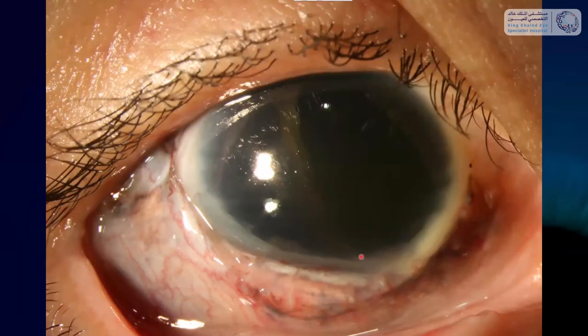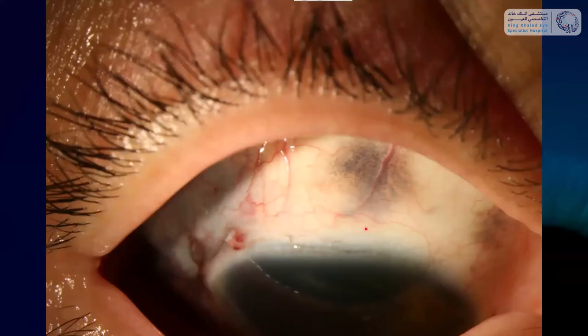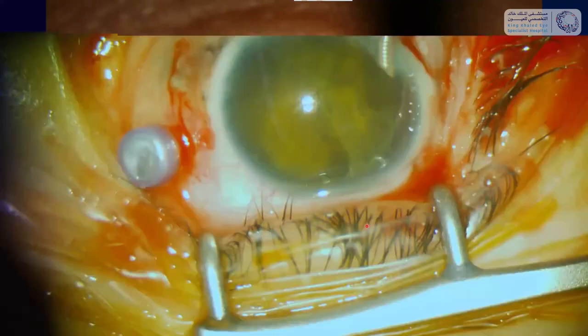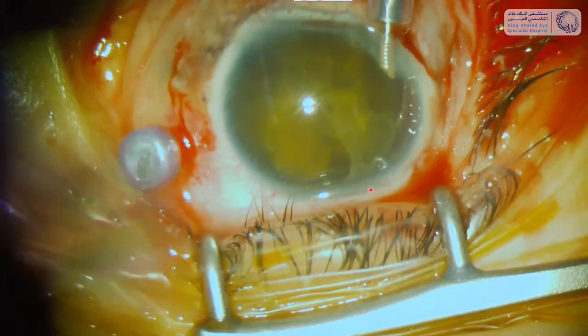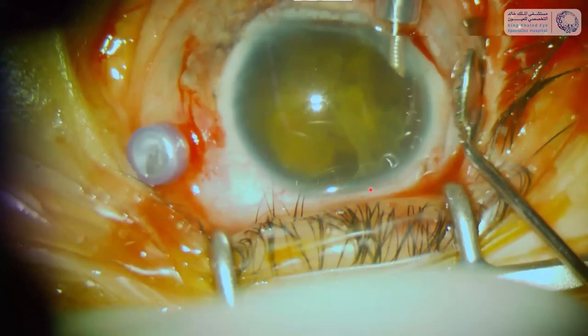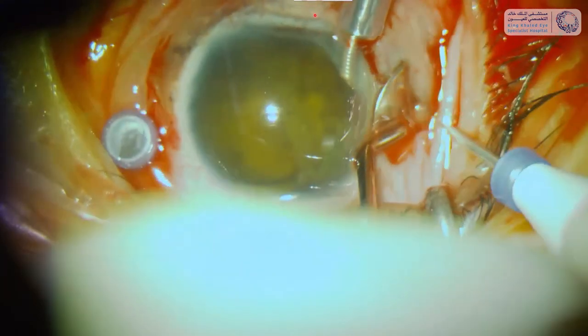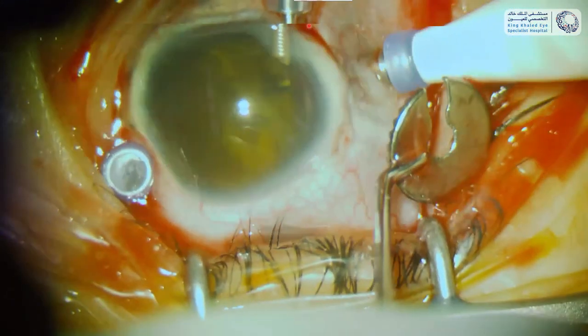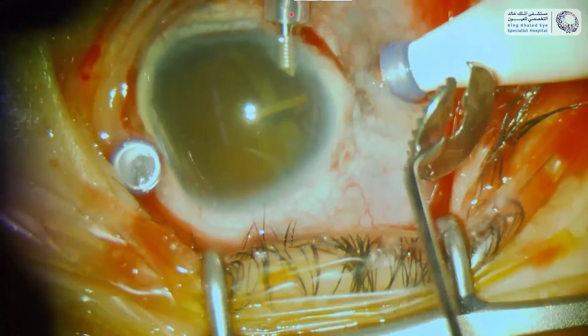The photo of the anterior segment showed siderosis on the cornea and some naked sclera — not looking good at all — but I wanted to give it a try. I installed an anterior chamber maintainer and inserted the cannulas very horizontally, not to end up under the retina or choroid. This is what I found: a funnel retina with some scars in the funnel and some scars under the funnel.